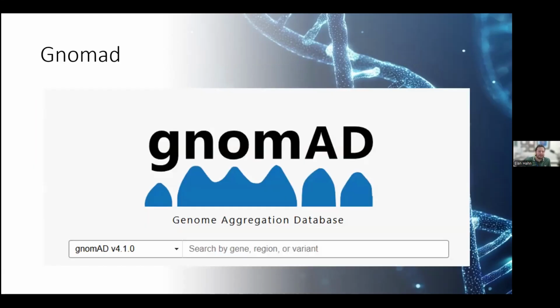So firstly, we could talk about gnomAD, and this is that population database. So this was made without paired normal tissue. The 1% minor allele frequency in the population is used typically as a cutoff of, if you see it above 1%, it's likely a polymorphism. Usually we use the global allele frequency, but it gives ethnicity-specific allele frequencies as well.